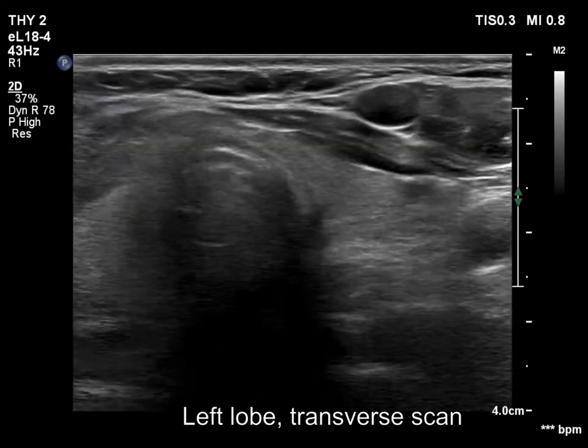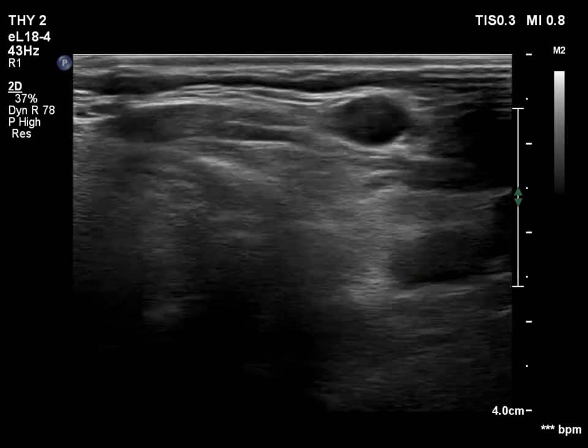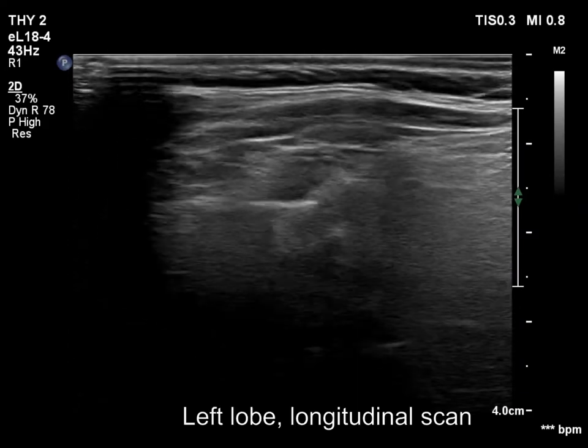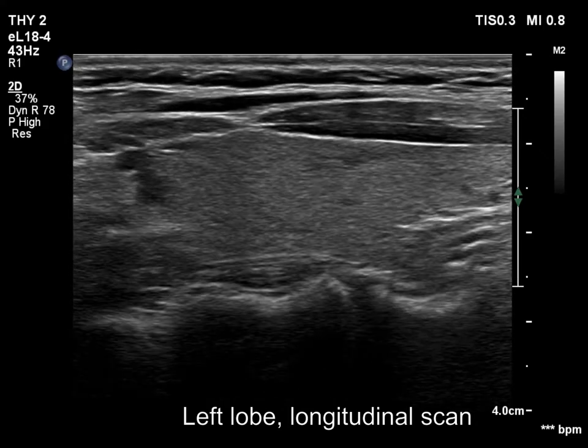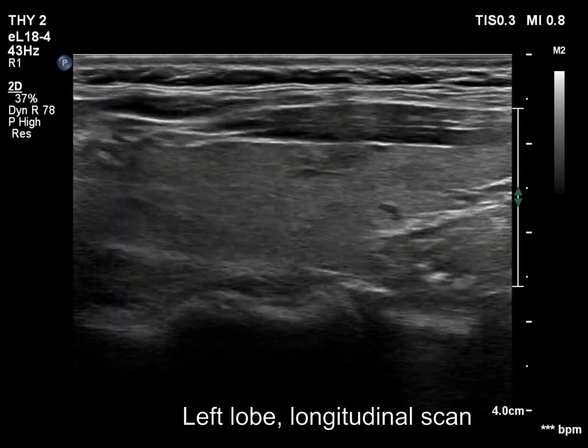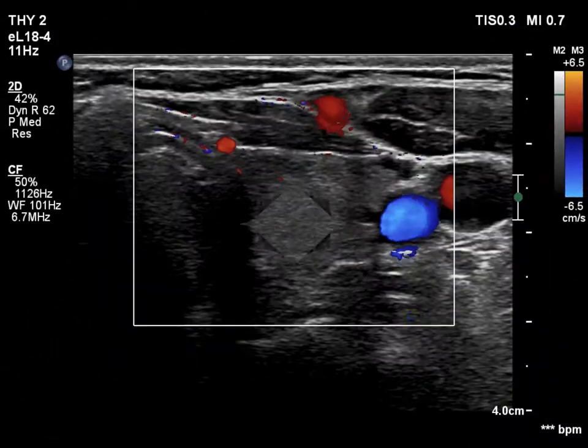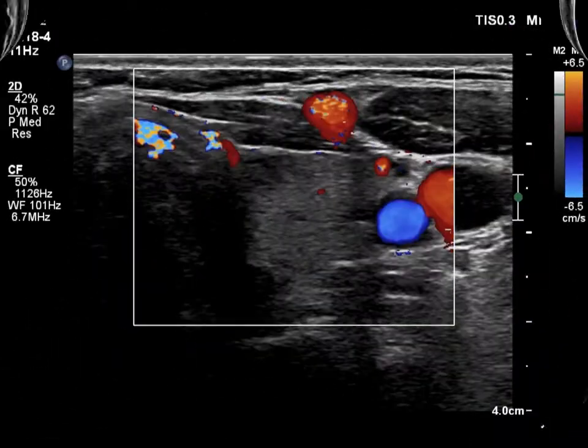The presentation of the left lobe is similar. Seeing only the ultrasound, the probability of subacute thyroiditis is quite low.